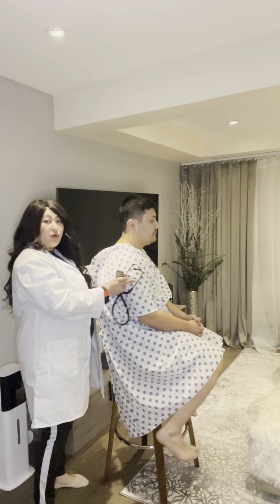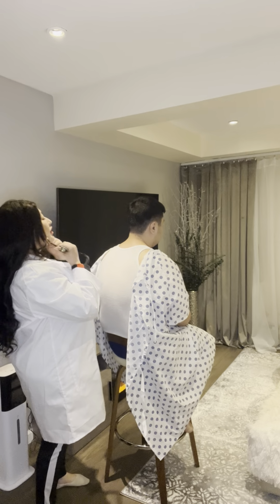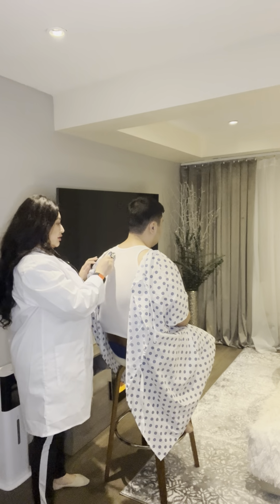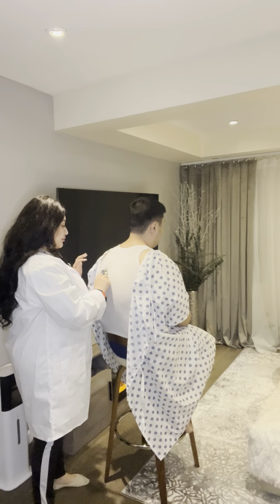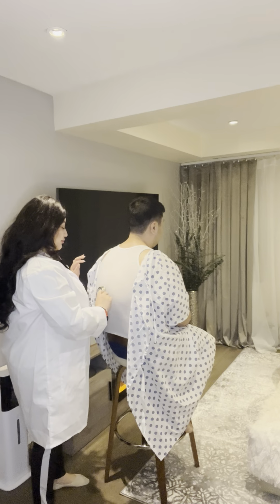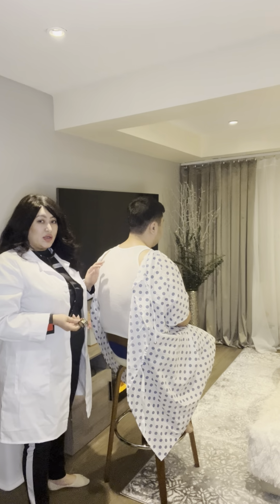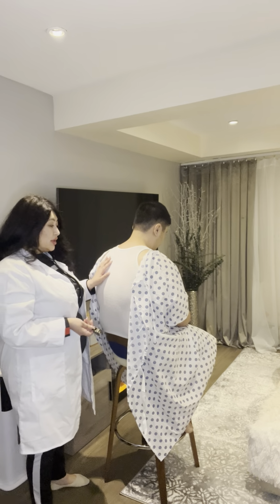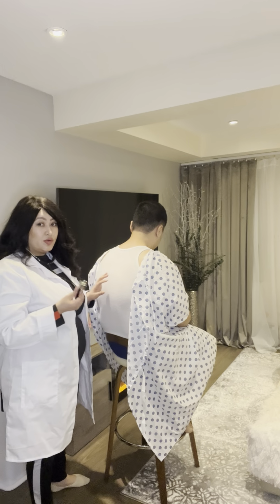Now I'm gonna assess for egophony. So each time I'm moving the stethoscope, please say E. E. E. E. E. E. Good. It's coming through like a muffled E sound. No consolidations, symmetrically. Now I'm gonna do bronchophony.